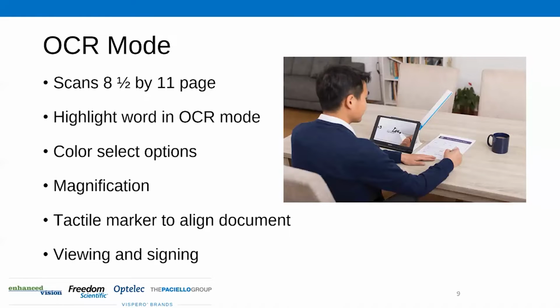And I will say one more thing, going back to these different modes that we have: you don't necessarily have to select any of these modes. They're in the device and they work intuitively. This is the other part of this device that's really impressed me, because we have to take really particular care when we're producing these types of devices, that they don't become an additional barrier for the people that we're trying to help.